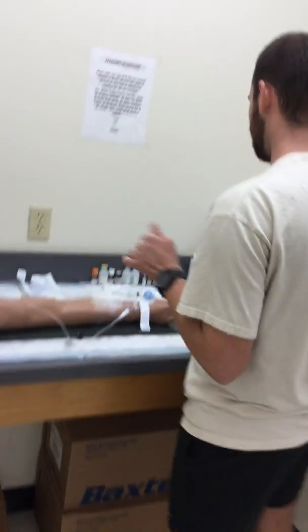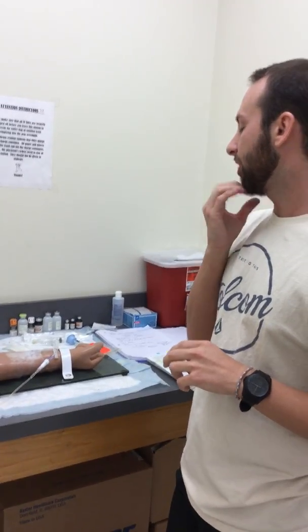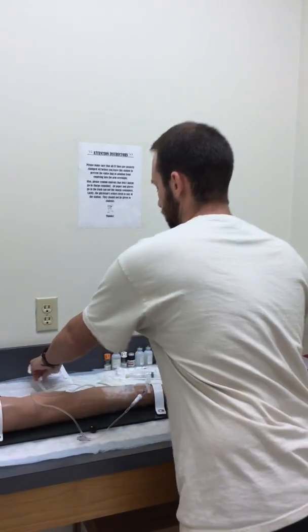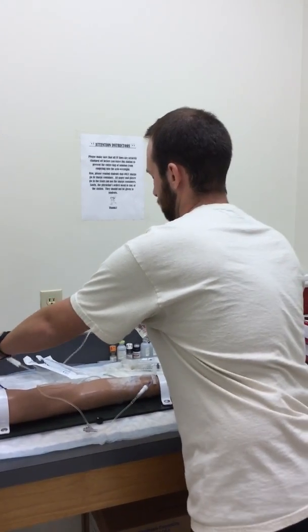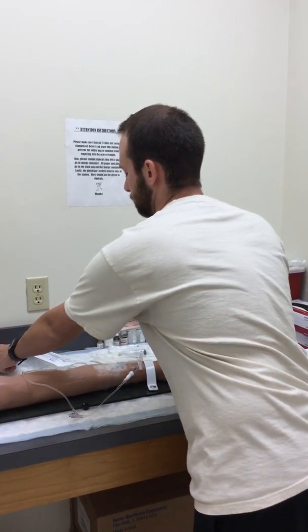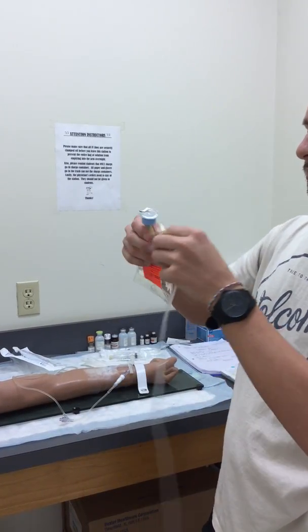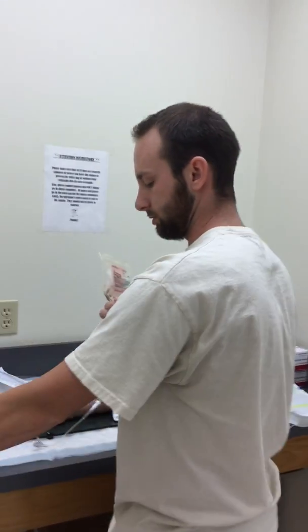Okay, so after we've done our IV push and we've got it done, we're going to want to go to our piggyback. We're going to want to prime it before we get to the room, in the nurse's station. I'm going to clamp this first so we don't just waste all of our medication. I'm going to plug this in. Make sure it's right. I'm going to make sure it's primed accurately, get rid of all of the bubbles.